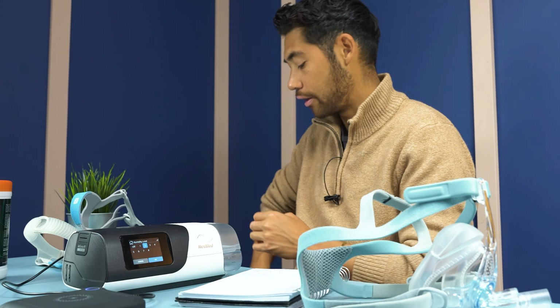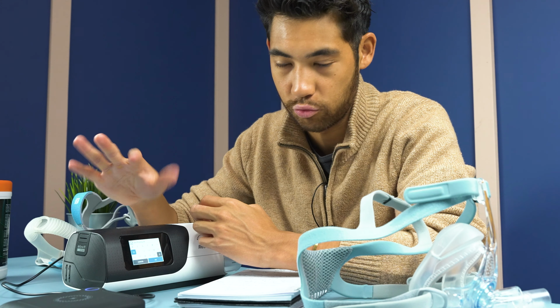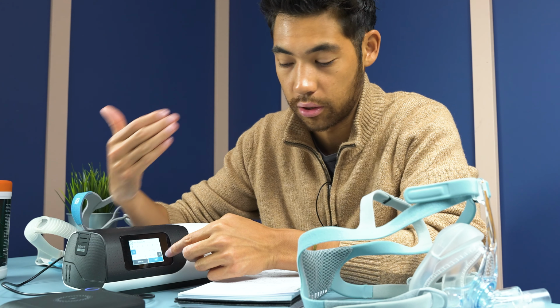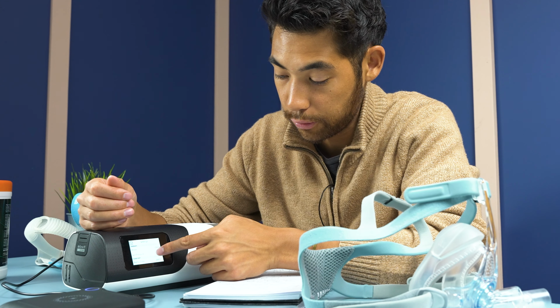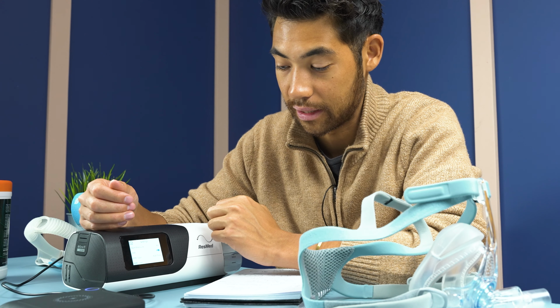Now, say you live in a remote location or you can't access a doctor, or you get the okay from your doctor to change some settings in your CPAP machine. You can take 2 fingers and put them on these buttons here. You're going to get into the clinical menu, and now we can change things in the CPAP machine. We have the mode for CPAP. We have set pressure. Here we have a pressure of 18, fairly high pressure. The average is around 10-ish, but your doctor will give you a pressure that works for you. And again, you can change ramp time, start pressure, stuff like that.